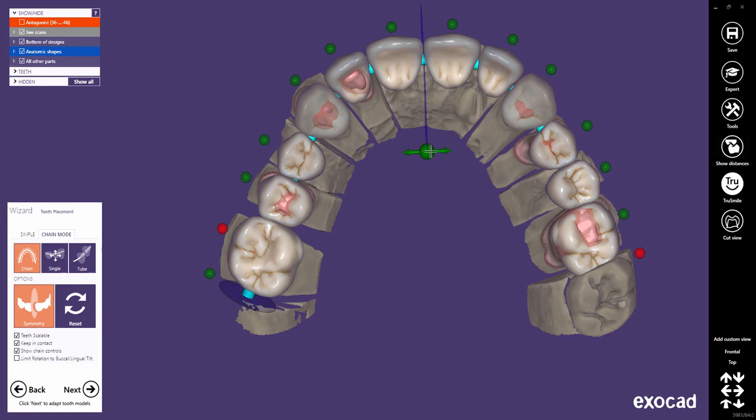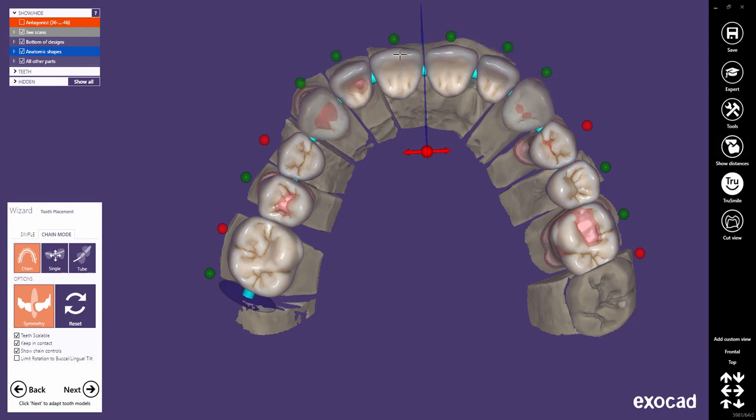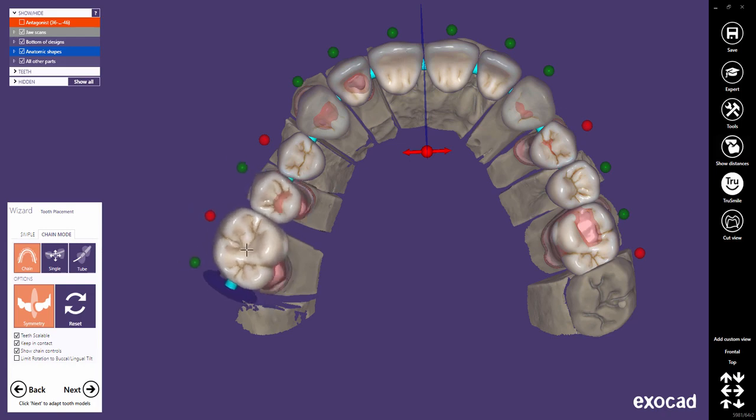If you lock the control point, the symmetry plane will stay in place. The control point's reference points are automatically pinned if you lock the front symmetry plane, and you can't unlock them as long as the symmetry plane remains locked. In a front symmetry, transformations for the posteriors will not be mirrored to the other side.